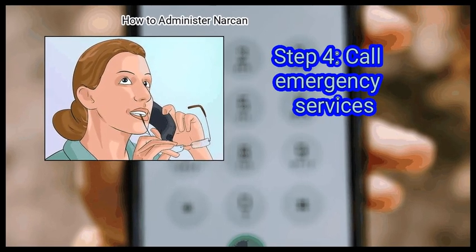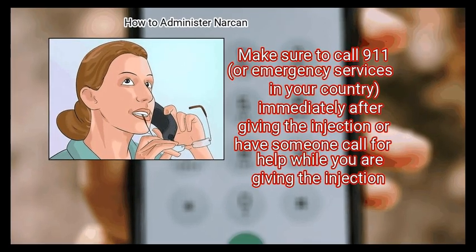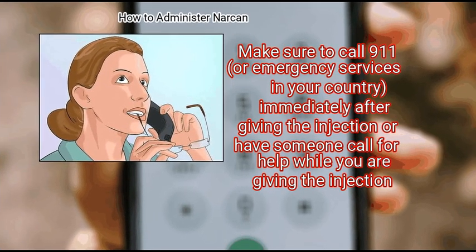Finally, call emergency services. Make sure to call 911 or emergency services in your country.